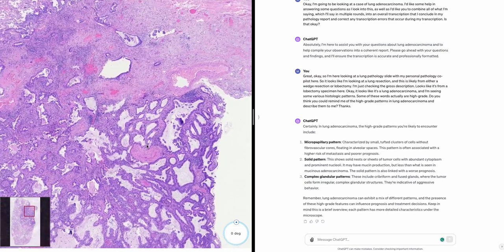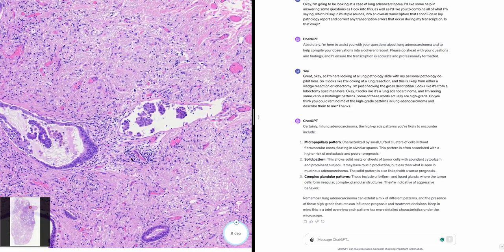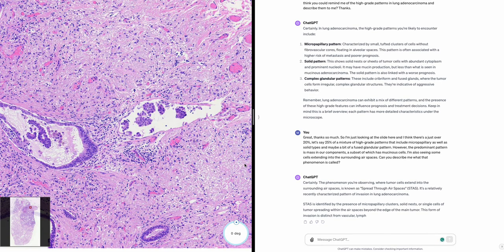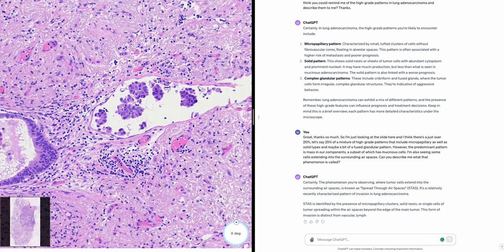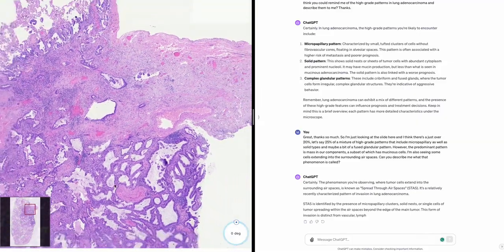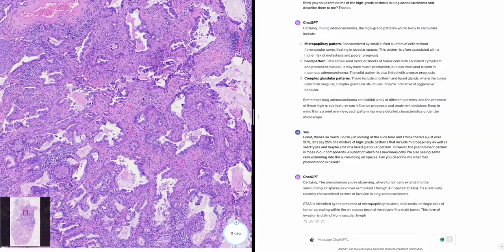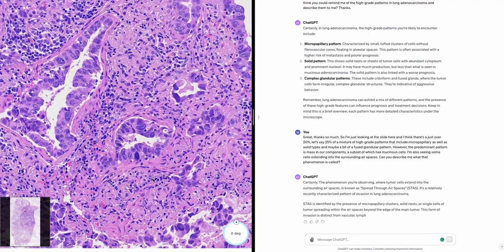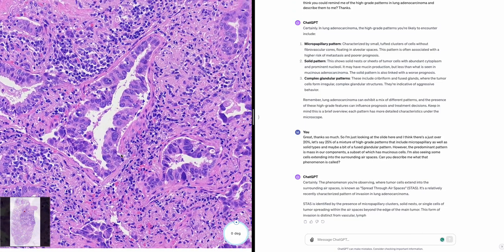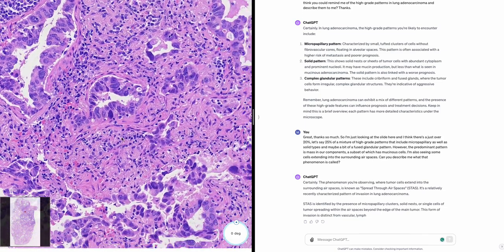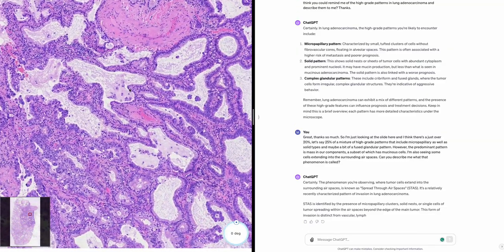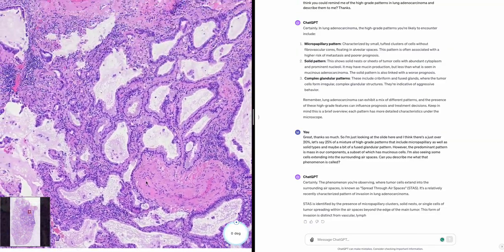I'm also seeing areas where there's tumor in lymphovascular spaces. Could you put all this together into a microscopic description? The cells range from cuboidal to columnar with atypical pleomorphic nuclei, focally prominent nucleoli, and interspersed mitotic figures. No definite squamous differentiation is seen.